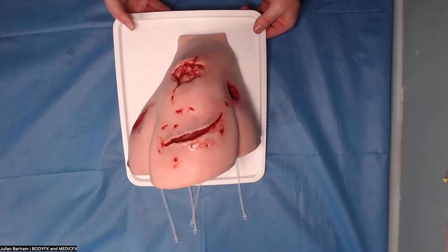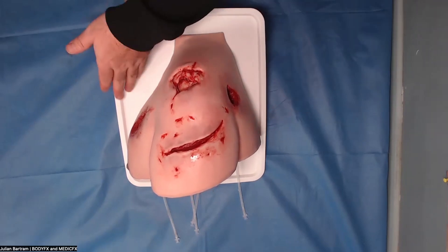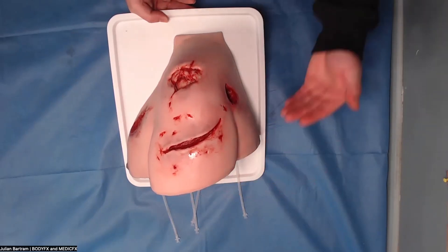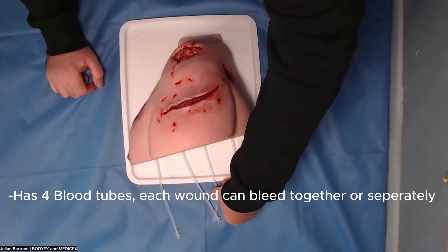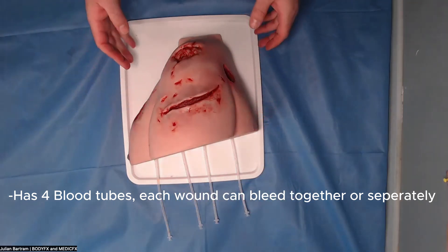This is the model itself. As you can see, it's a model of like the quarter of a torso and the upper part of the arm. It has four blood tubes inserted into it so each of the four wounds can bleed.